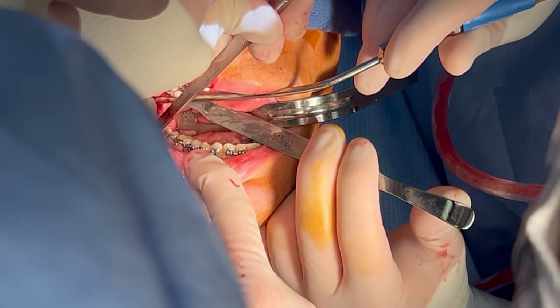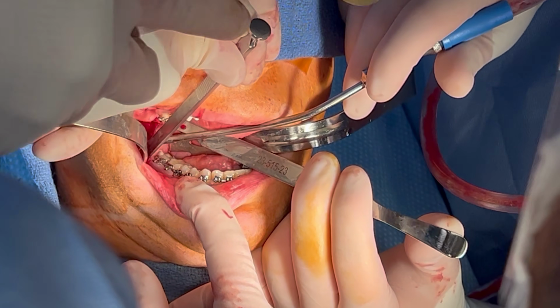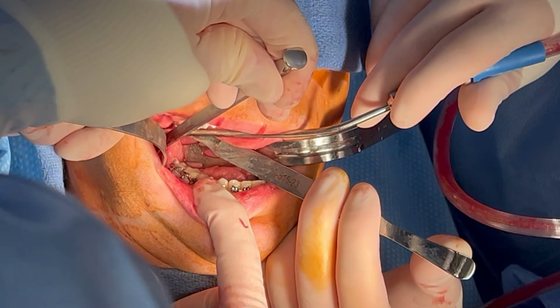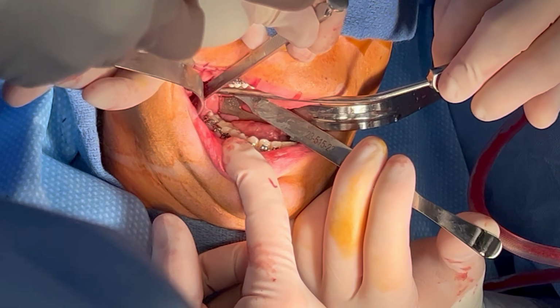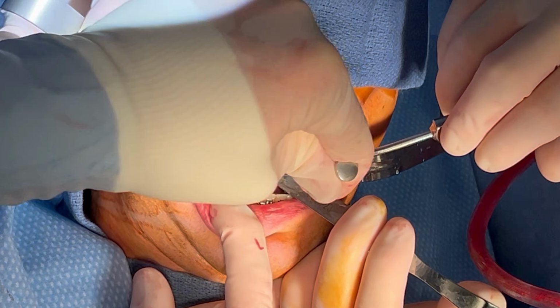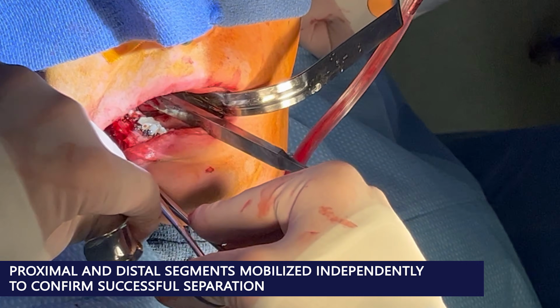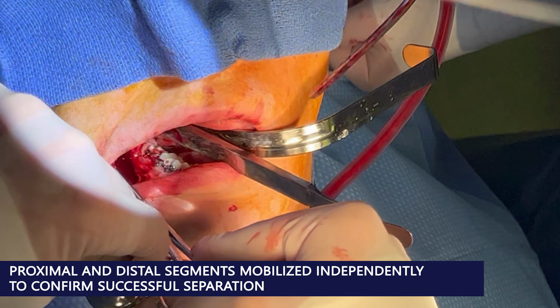The mandible is split sagittally using chisels and a mallet. This separates the proximal segments, which includes the condyles, and the distal segment, the tooth-bearing portion of the mandible.